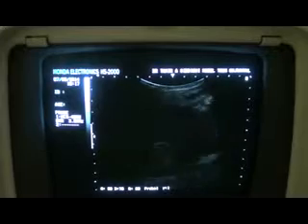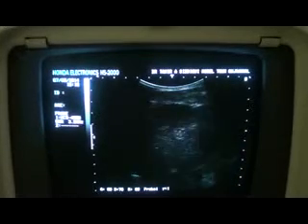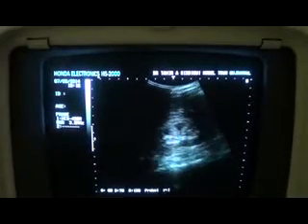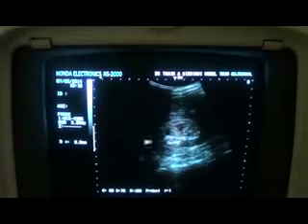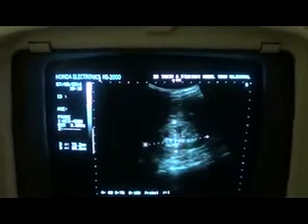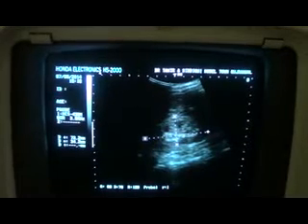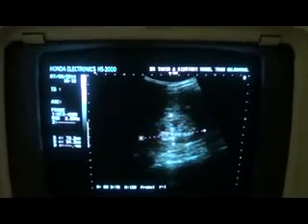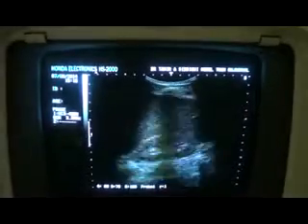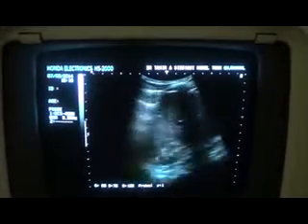Now because of this, let's see the right kidney. Now the right kidney is showing us diffuse, raised parenchymal echogenicity. This is the right kidney, measuring 7.3 by 3.4 centimeter. Central sinus echo complex is muffled, and though a few pyramids are seen, the rest are muffled. So this kidney does show grade 1 parenchymal changes.